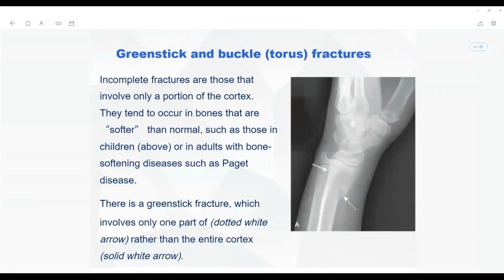So multiple investigations may be necessary. For example, I am going to look at today's x-ray and compare it to the x-ray that was taken 15 days ago. So x-rays taken at multiple times, multiple investigations, you always need to compare.